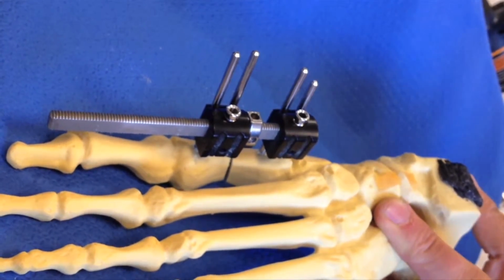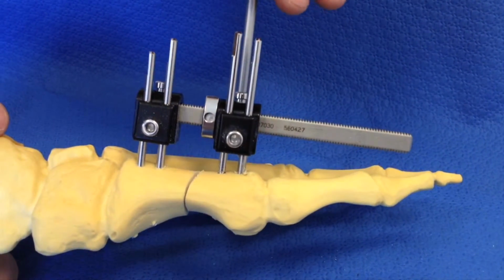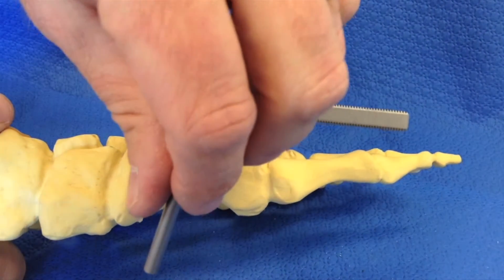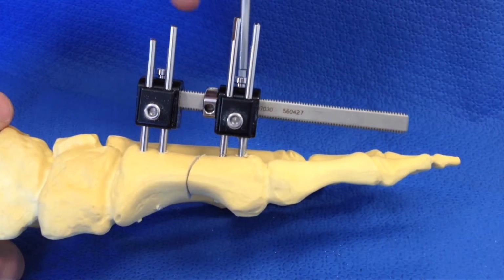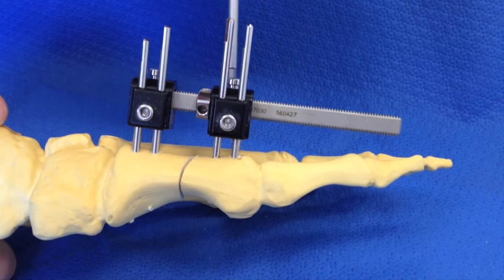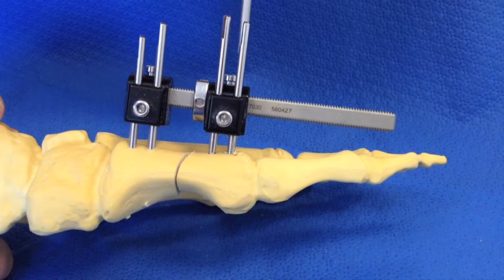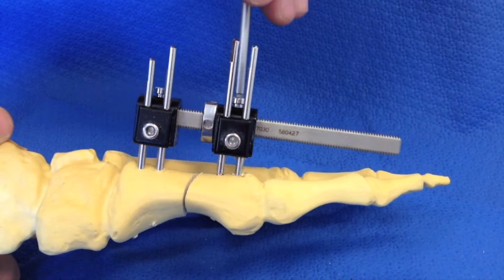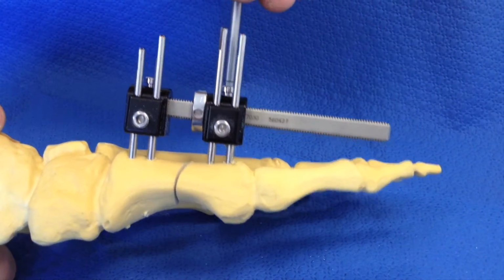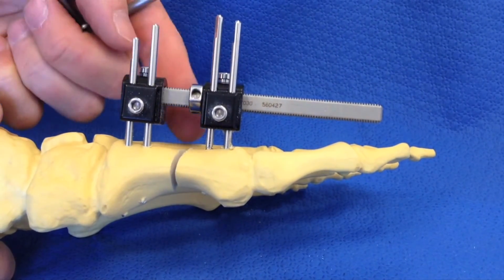And that's 1/4 turn. So over time, when we do this 1/4 turn twice a day, over and over again, there's my 1/4 turn, I'm going to lock that, and then I'm going to come back again later, there's my 1/4 turn, I'm going to lock it again. You can see the space here starts to get bigger. And if we fast forward, after multiple turns, you can see that growing.